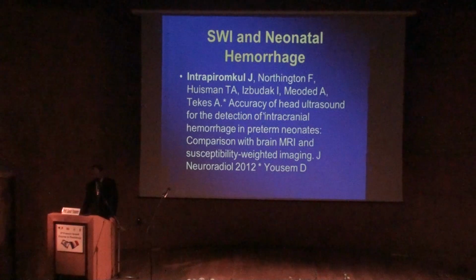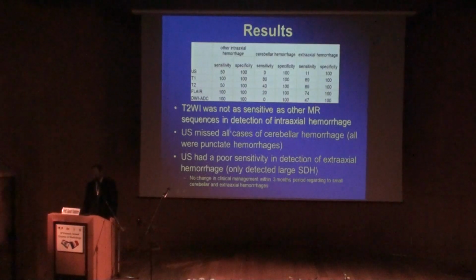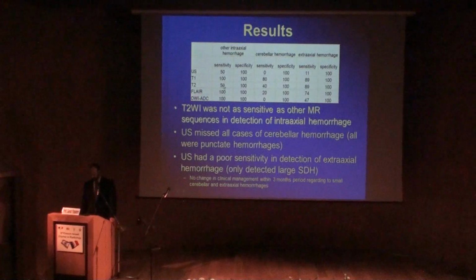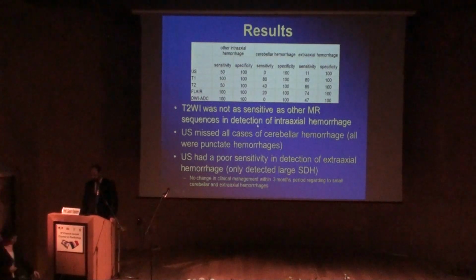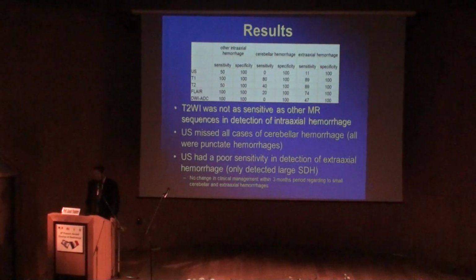So, looking at the value of SWI to ultrasound in neonates, this is what we found. We found that although ultrasound was very useful, there was a role for SWI, particularly in the posterior fossa and in demonstrating parenchymal hemorrhage.